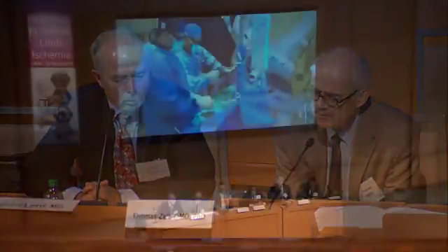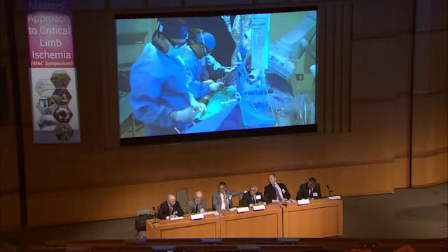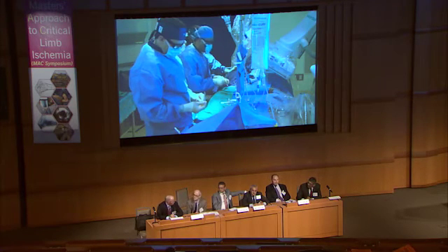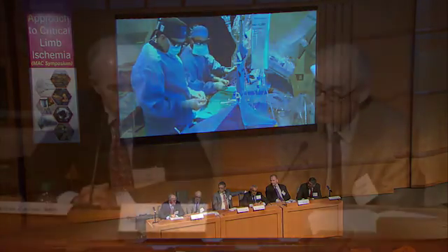Can I get some more saline here? Is there any DES in the US approved for below the knee use? No. Because in Europe, the Promos and also the Science, they have below the knee approval. Do you actually get reimbursed when you use them? No, but they are so cheap, not significantly more expensive than bare metal stents for below the knee, so there is no big difference.